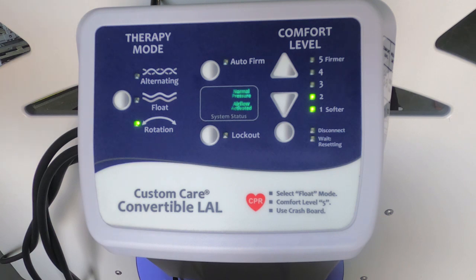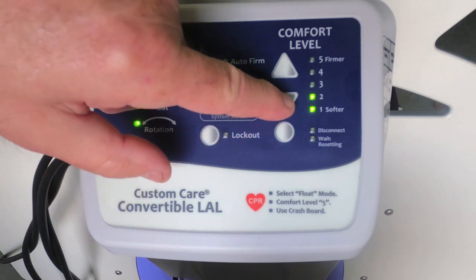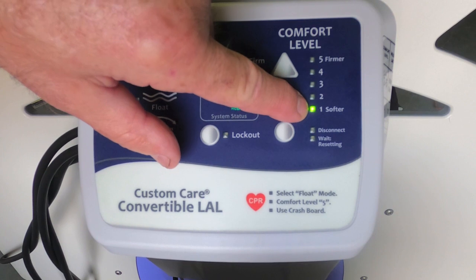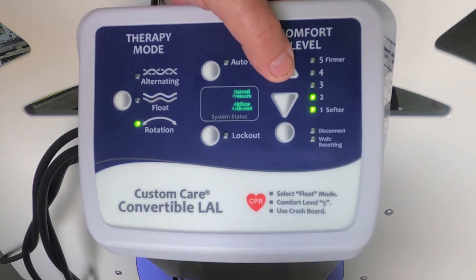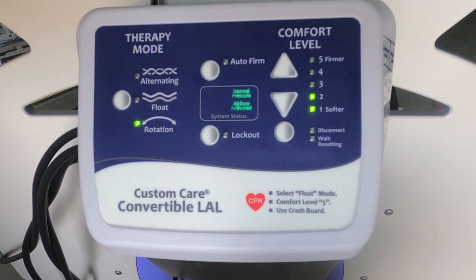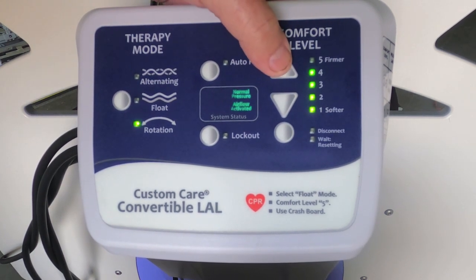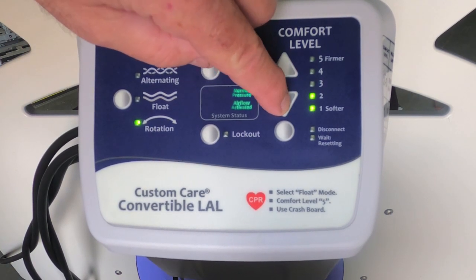There are additional settings on the controller that you need to be aware of also. The first is the comfort level, which is on the right-hand side. This is generally set by pushing these arrows, and you have a range from 1 to 5, 5 being firmer, 1 being softer. And generally on patients of 120 pounds or less, your initial setting is going to be 1. If you have larger patients, you can increase that to where you have good immersion of the patient. Actually, the less air you have delivered to the system, the more immersion you're going to get. But you also want to make sure that the patient is properly supported and they're comfortable. So this is your range. Anyone over 120 up to 500 pounds, you would use settings from 2 to 5.